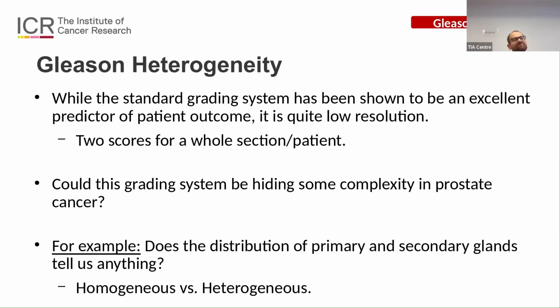So that is standard grading, but I want to now move on to another way of looking at Gleason grading, because if we just simply take the segmentation and convert down to a primary and secondary pattern, we're really underselling what we can do with this technology. It's not to say that standard Gleason grading is a problem, but it's low resolution by necessity. A pathologist can't segment out all the regions, it's just not feasible.